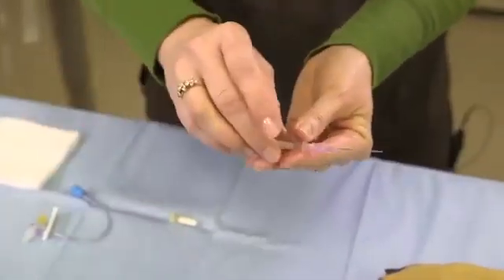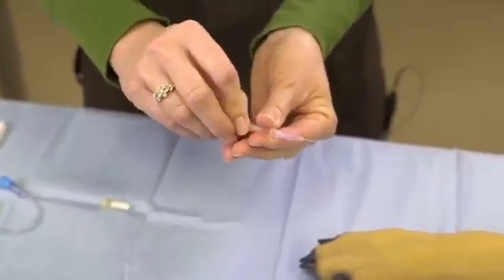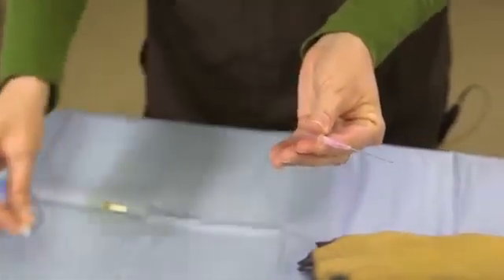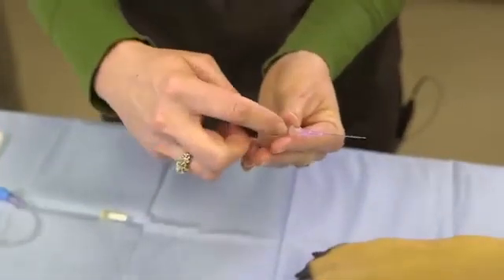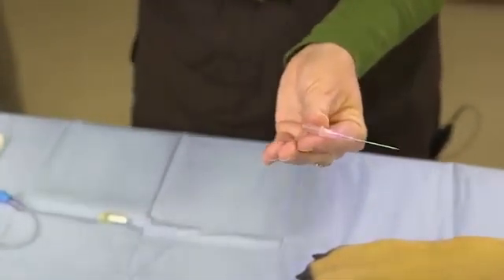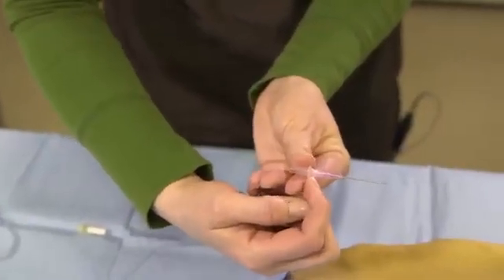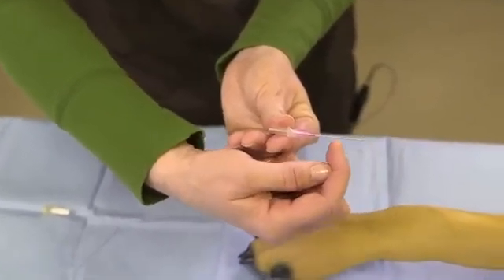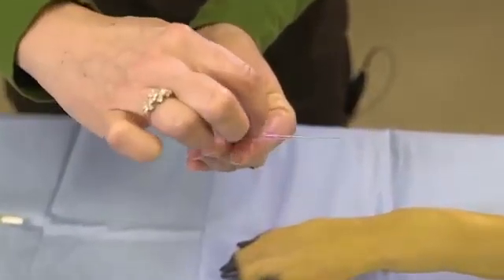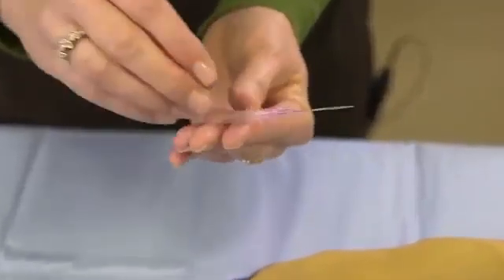So, when you are about to place the catheter into the vein, go ahead and take off your cap. That will allow the blood to freely flow into the stylet. When you're in the vein, you'll want to be able to see this portion of your catheter because the blood will come into your stylet and will enter your hub. When you have blood in your hub, you know you're in your vein.